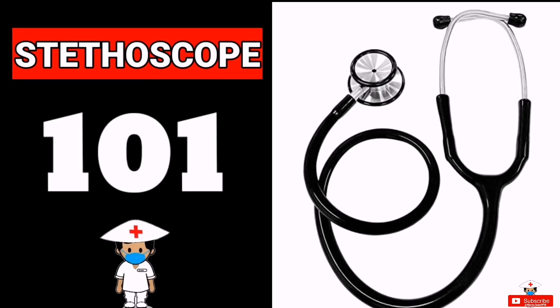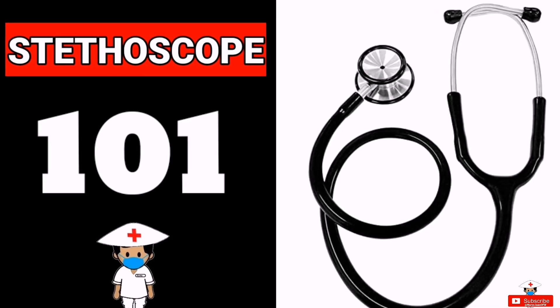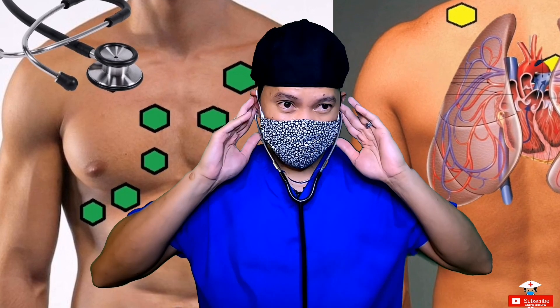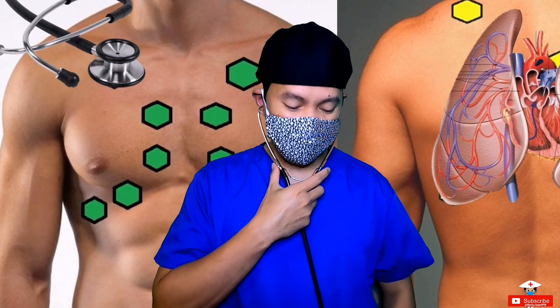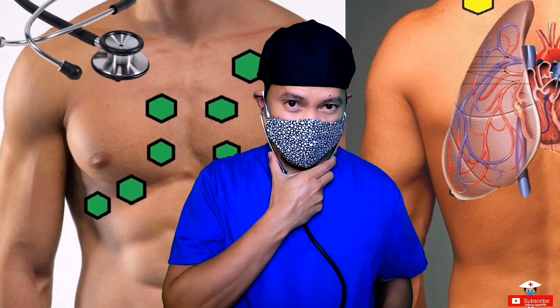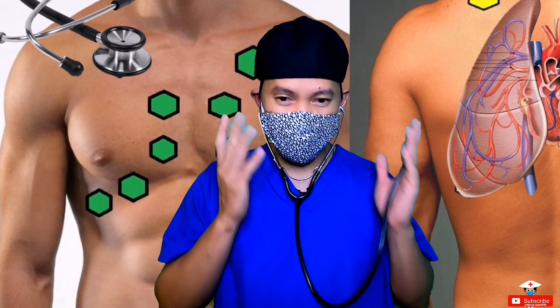First thing you have to learn is how to use a stethoscope. Here are some tips and tricks for you to use. Number one: make sure to angle the earpiece towards your nose before wearing it. Then make sure it is snug fit to your ears as it forms a seal inside your ear, lessening the sounds you hear outside the stethoscope.